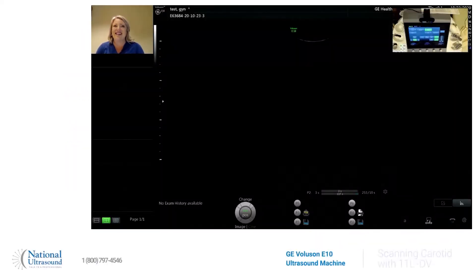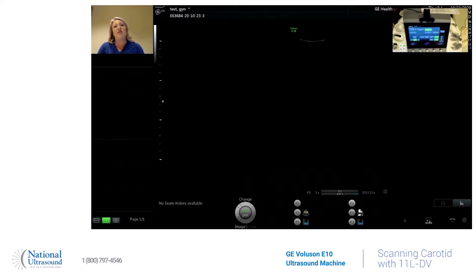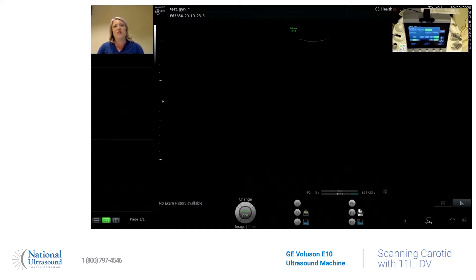Hey guys, this is Holly. I am a registered cardiovascular general and OBGYN sonographer since 2008. Today at National Ultrasound, I have the GE Voluson E10, which is known for its women's health care image quality. But today, I want to show the vascular quality of this machine.